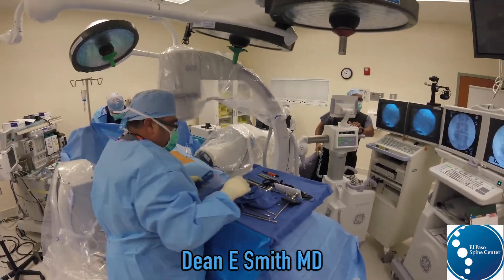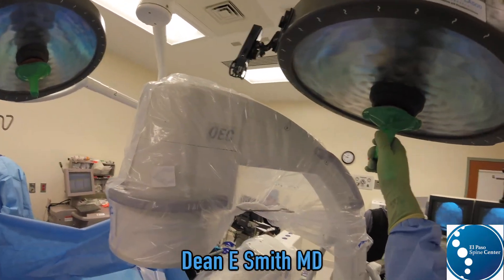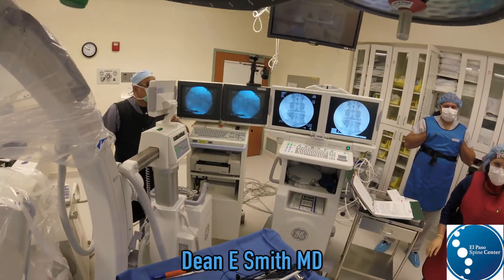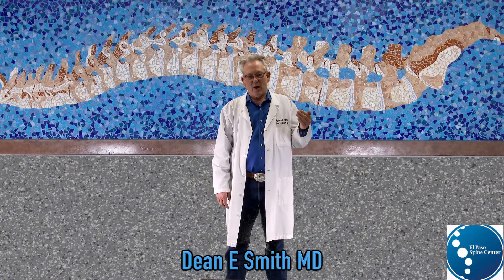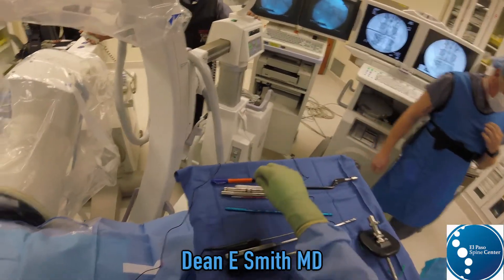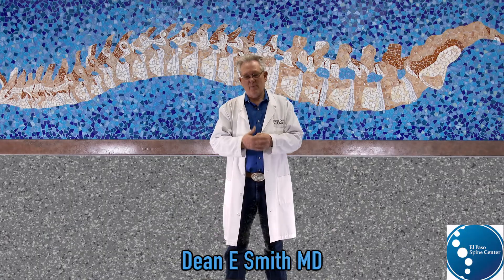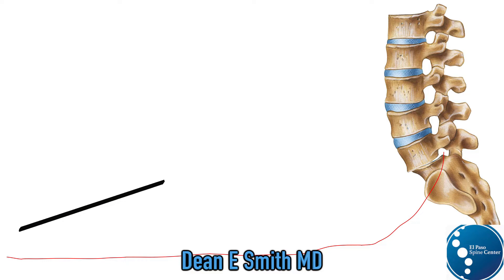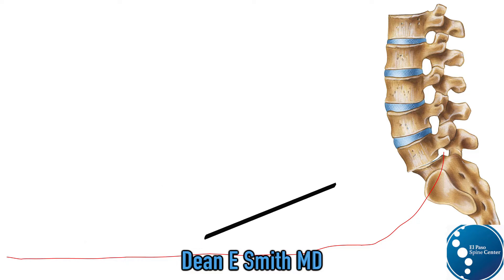We use a minimally invasive technique. Initially, under fluoroscopic guidance and spinal cord monitoring, an incision is made of about one centimeter. The rod is passed down into the abdomen, and we find where the bones are locked or interdigitated together. Using that rod kind of like a crowbar, we open up or disimpact the bones.